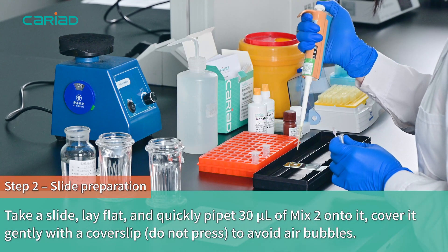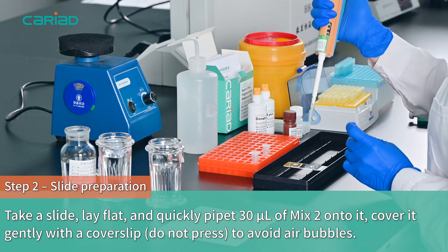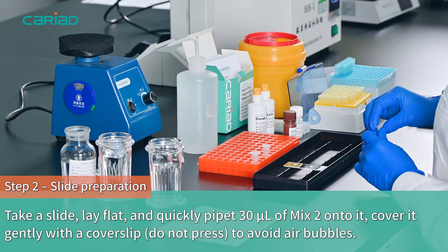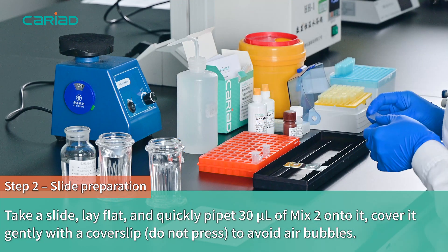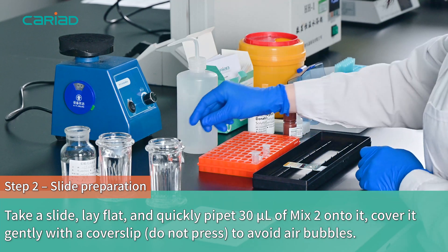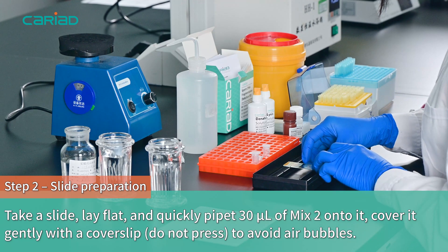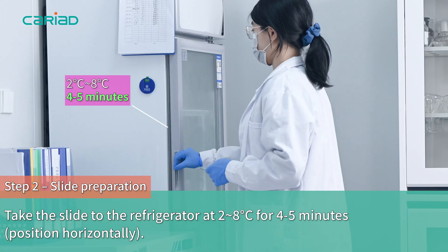Slide Preparation. Take a slide, lay flat and quickly pipette 30 microliters of Mix 2 onto it. Cover it gently with a cover slip to avoid air bubbles. Take the slide to the refrigerator at 2 to 8 degrees for 4 to 5 minutes.